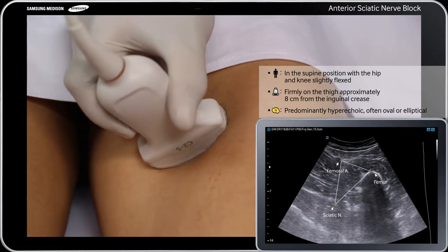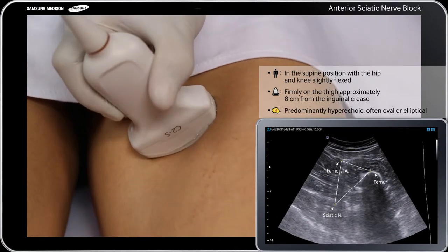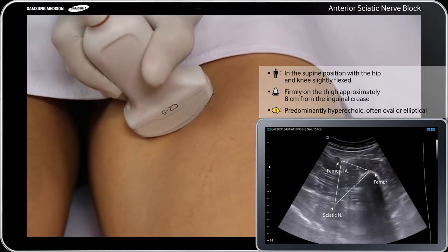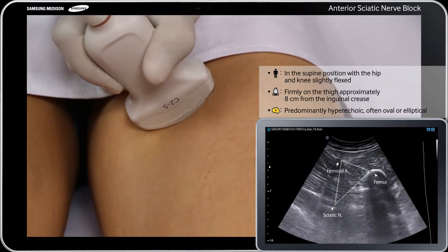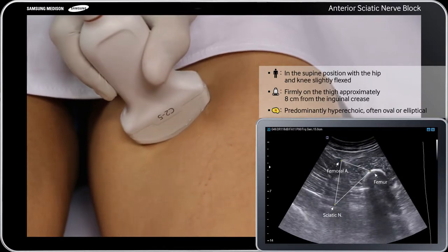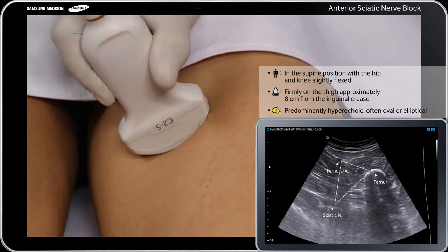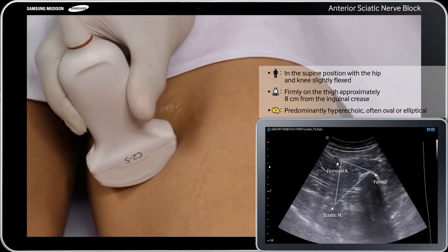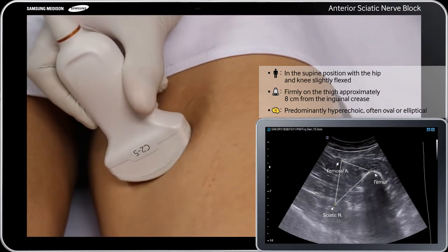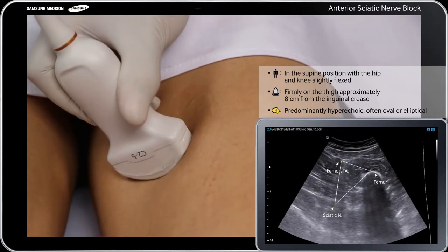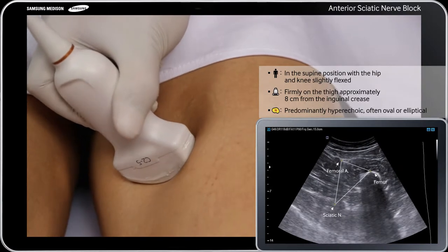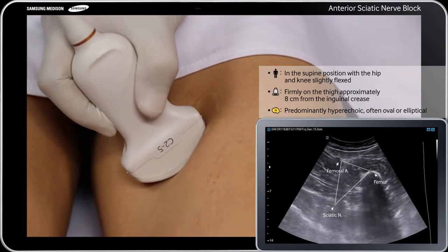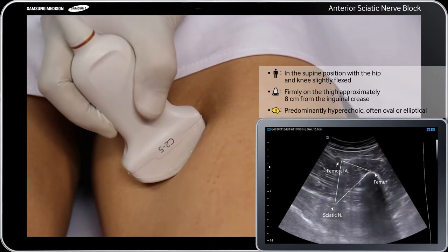After preparing the patient's skin and the transducer, place a low-frequency 2 to 5 MHz curved transducer firmly on the thigh, approximately 8 cm from the inguinal crease. Observe on the screen the transverse view of the femur and the sciatic nerve in short axis.